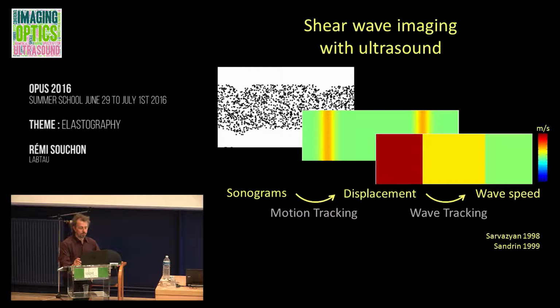And now, shear wave imaging with ultrasound: you'll see that in most cases you can just use a simple push. What we'll be doing is creating a transient shear wave in the middle of the field of view using radiation force or whatever vibrator you can think of.